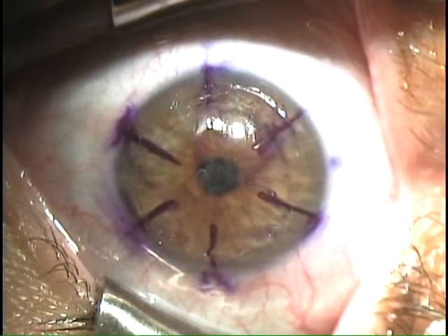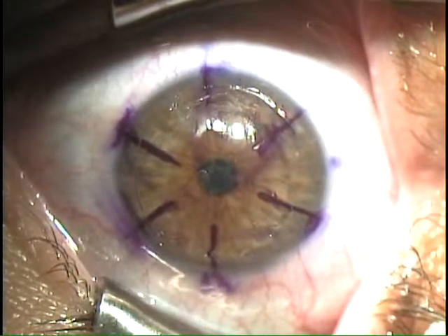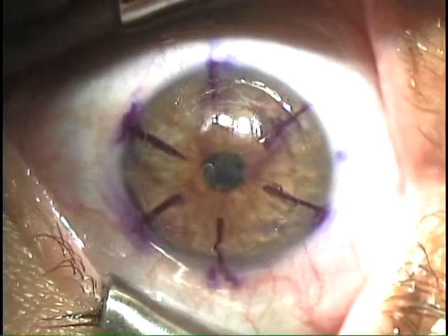Looks very, very good. Okay. And that's the procedure. We'll be looking at her again in about 30 minutes.